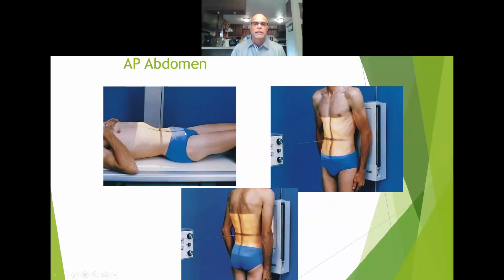So again, guys, if you're not going to get comfortable palpating for that little small pubic symphysis bone, this is medical palpating. We will show you this in clinic how to do it. We will tell the patient what we're going to do. We're going to ask permission if it's okay for us to touch. If not, we can demonstrate on ourselves and ask them to find the little hard spot right below their bladder. Leave their hand there, then you can place your hand below that, and that will give you a landmark. Or again, you can go with the greater trochanter.